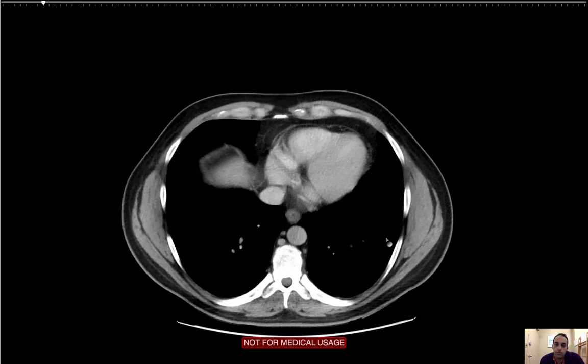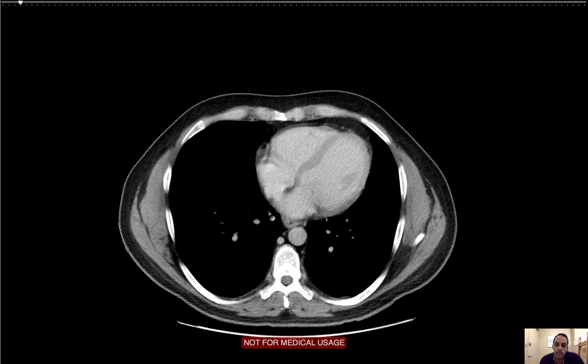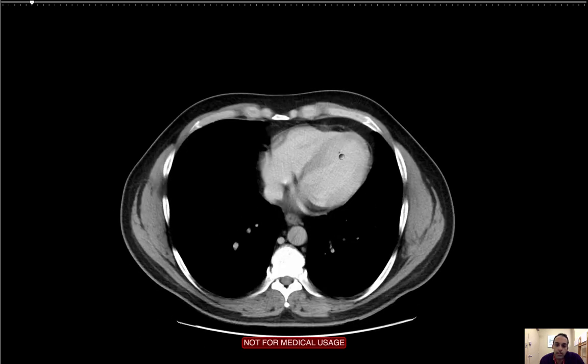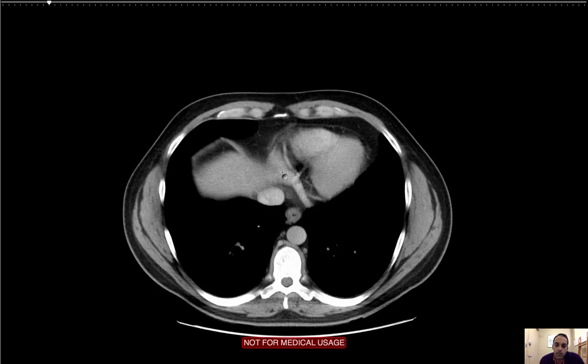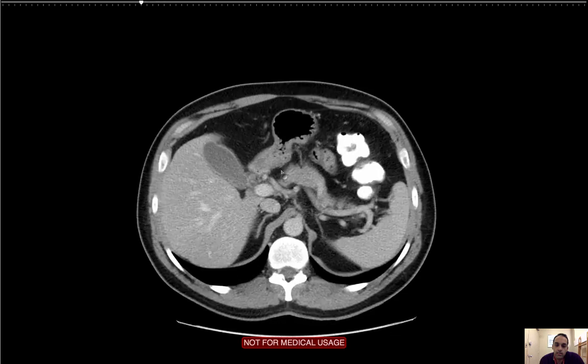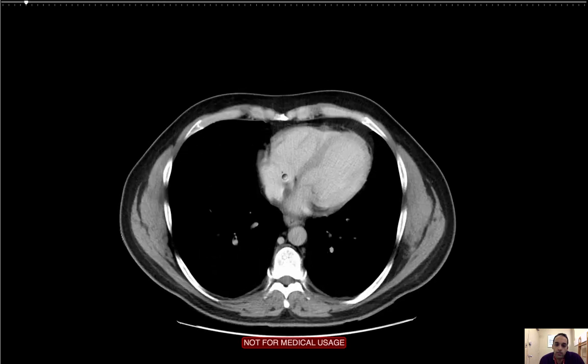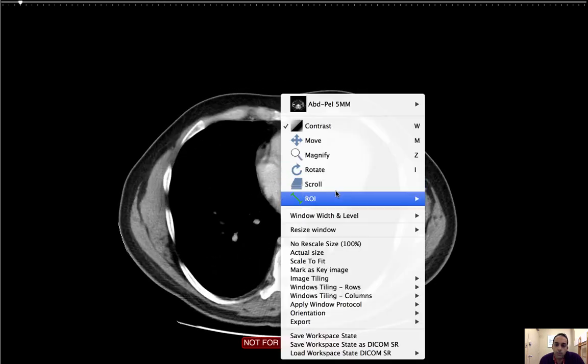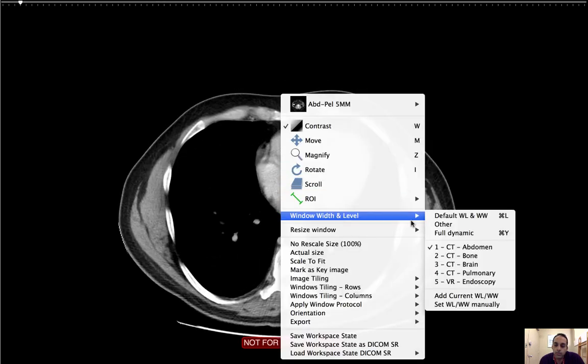Switching over to abdominal windows, looking at the heart, looking for overall size. I'm looking for any pericardial effusion, which I don't see. The heart is normal size. There's no pericardial effusion.